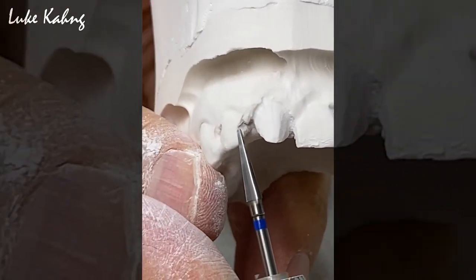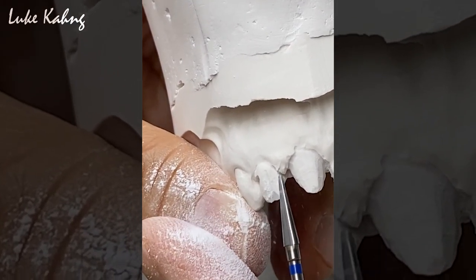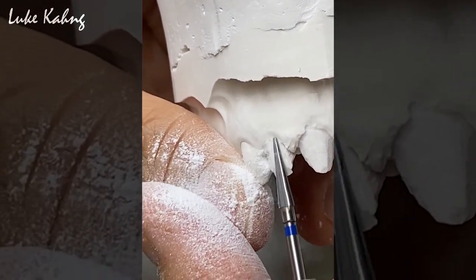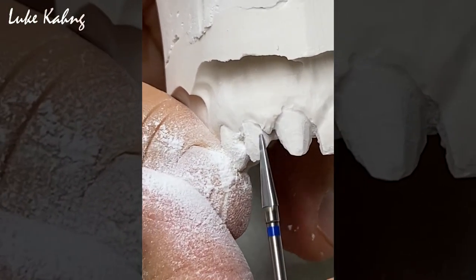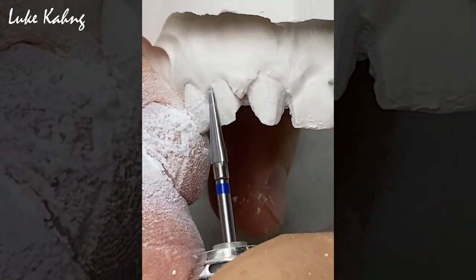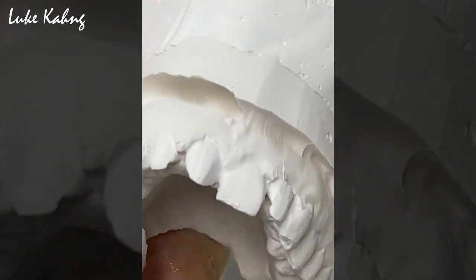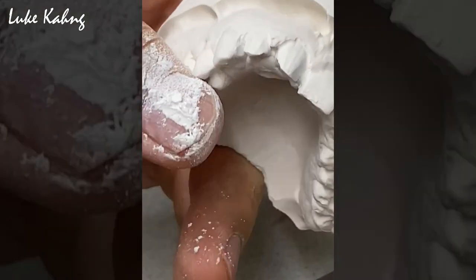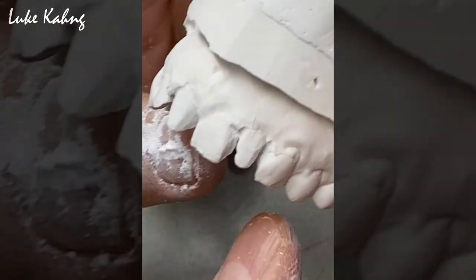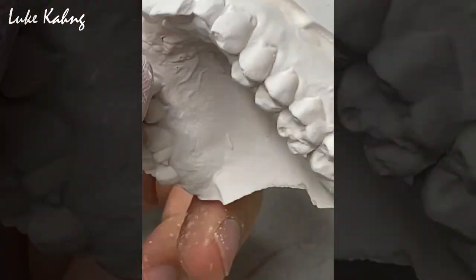So this one has to be ground more, at least 2 millimeters, probably 3 millimeters if they can, or they need to make it endo, root canal. They have to do it in order to make the perfect piece, or sometimes they have to extract the piece, right? I like the virgin teeth, canine, great shape, very comfortable with this. So this is my format. I can reshape this.